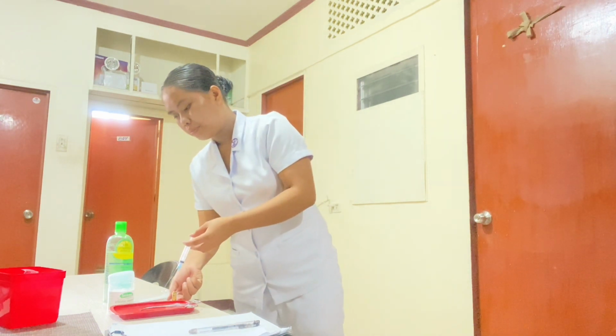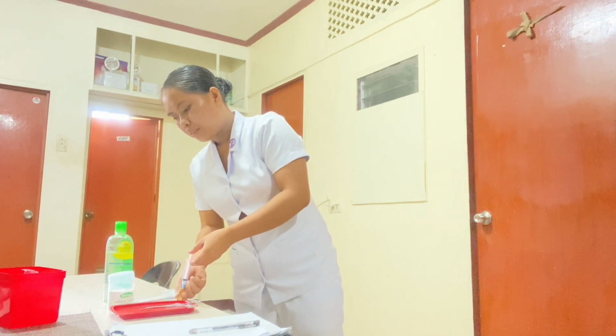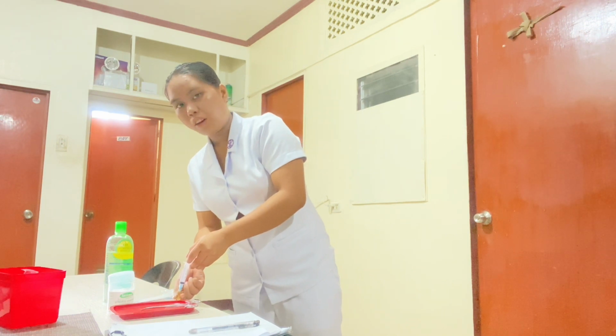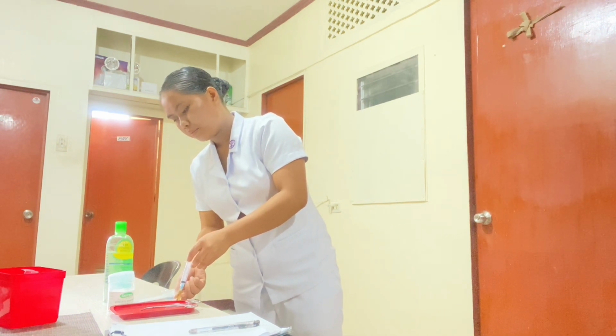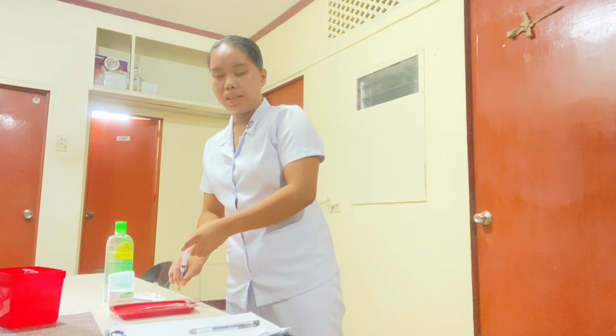Insert the needle tip into the center of the ampule. Do not touch the rim of the ampule. For a single dose ampule, hold it on its side.